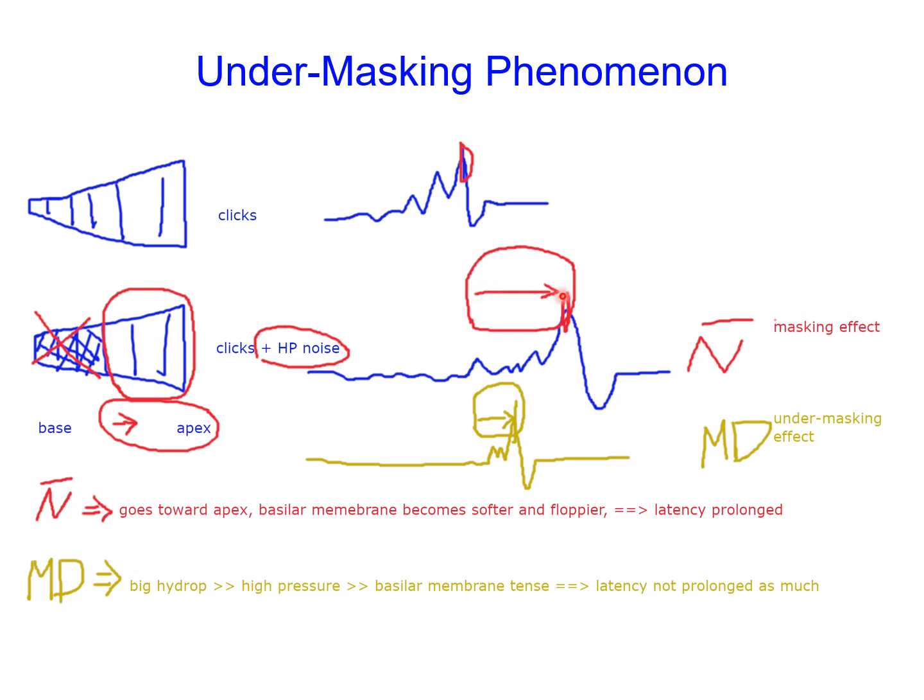So it is as expected, because this is the normal physiological property of the cochlea and human auditory system. This is the effect of delivering masking noise to the test ear. So this is called the masking effect. When we present ipsilateral high-pass masking noise, we expect ABR wave V latency to be prolonged. And for a normal cochlea, this increment of wave V latency is quite substantial, like shown here.